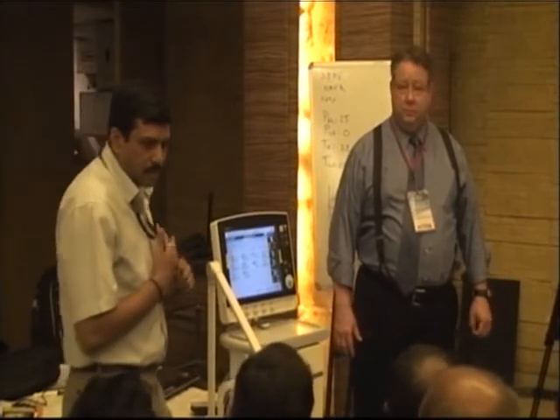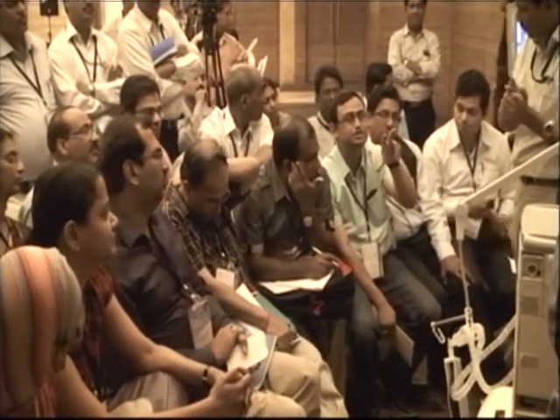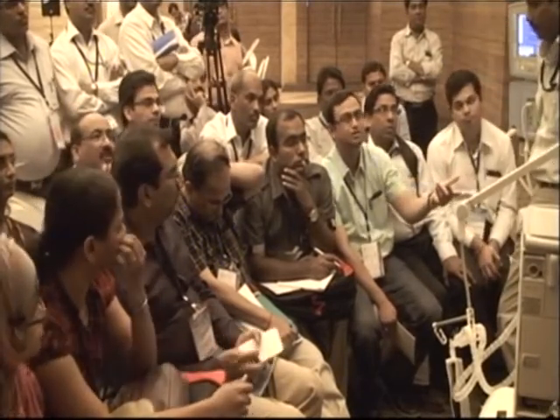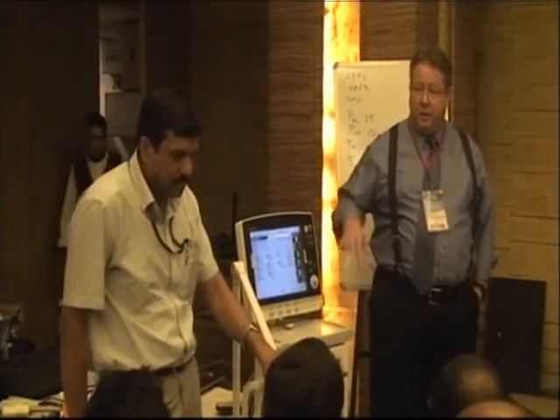In case of CPAP failure, we can directly use this instead of conventional mechanical ventilation. Do you mean just with a mask? Oh, I see what you're saying. You could use it in other ventilation also. Yeah, you absolutely could. You just probably wouldn't set it as high. Is it working better than mechanical ventilation? It might. Yeah, it really depends on your lung process.